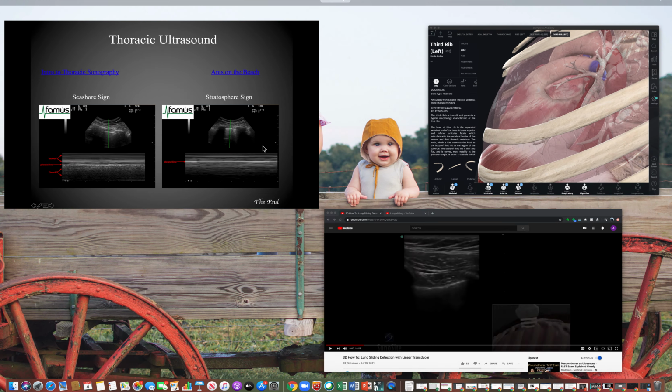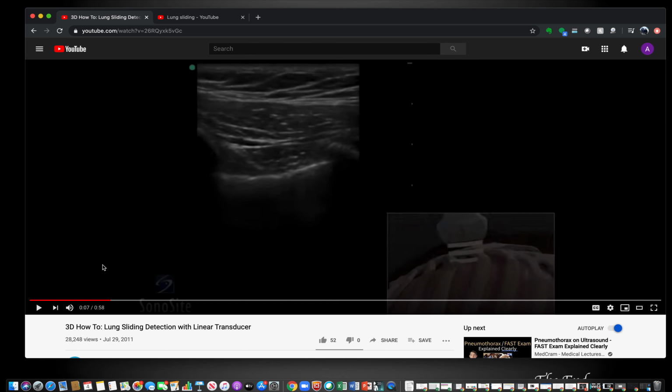So just real quick, I wanted to end with two quick videos. So this one's first going to introduce this ants on the beach idea. So I'm just going to let the video play.